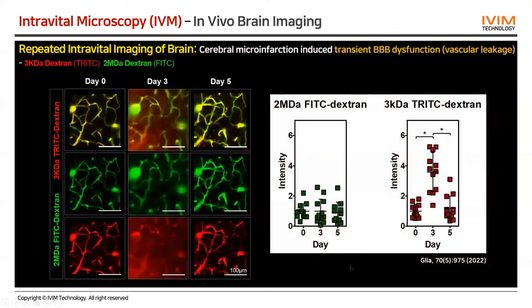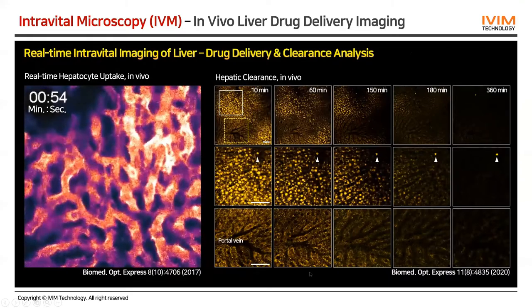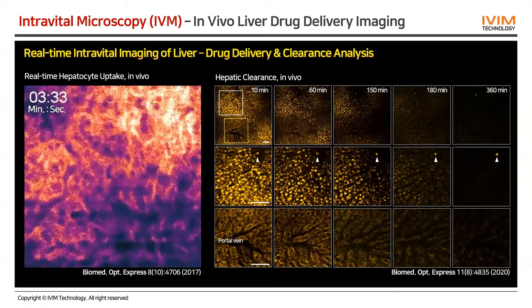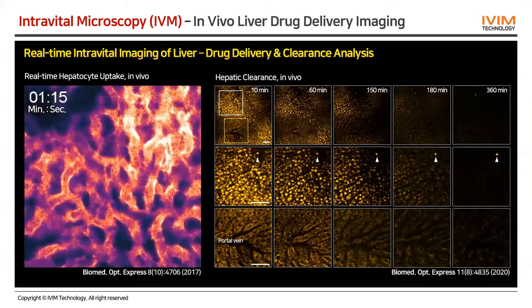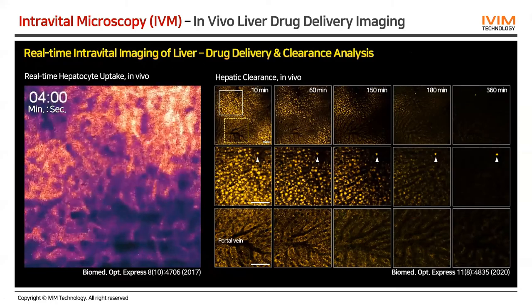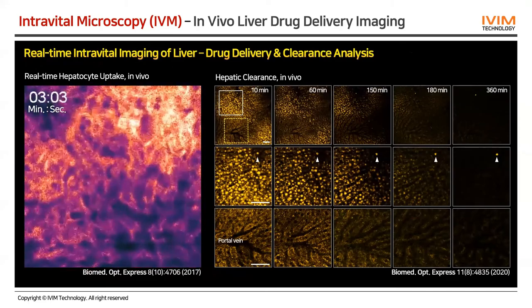So up to here, I showed you intravital imaging of a live animal model from several minutes to several hours. That's the typical time frame we can image one mouse model in a single imaging session.